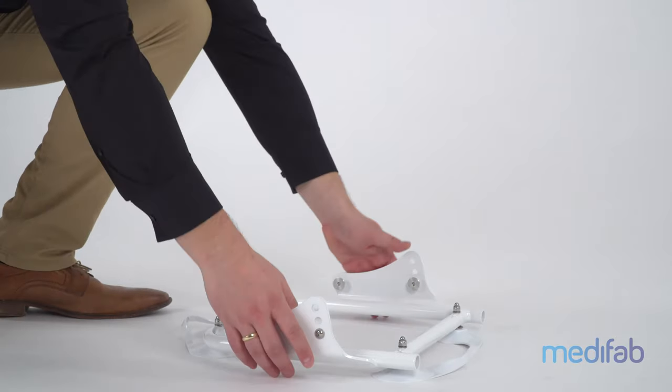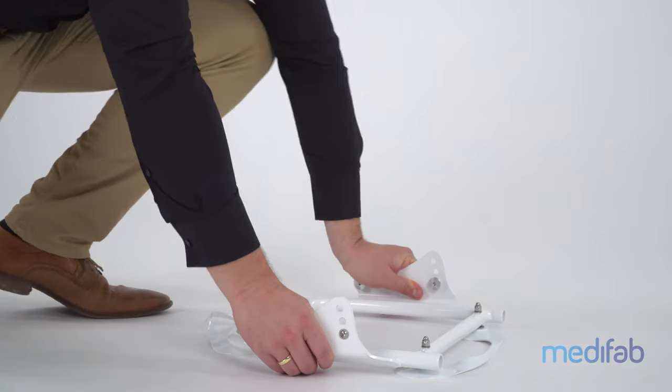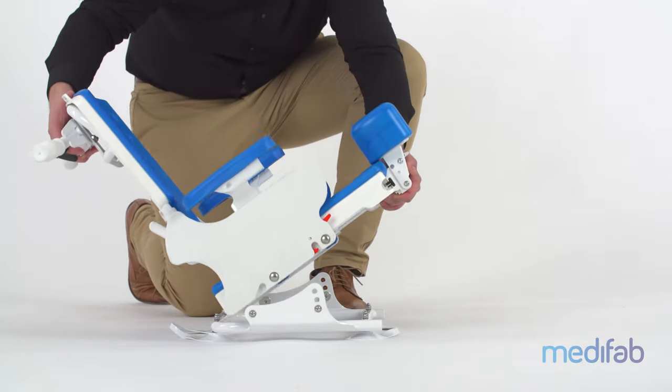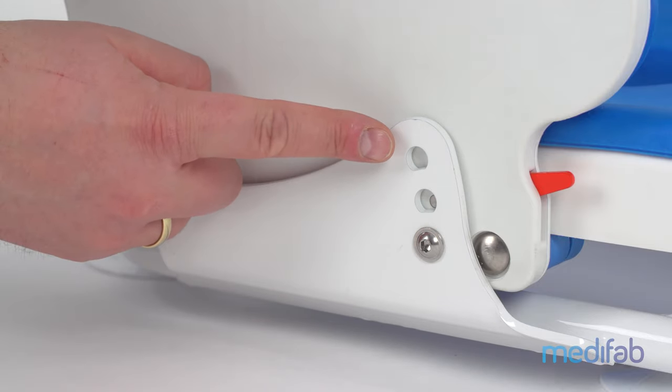For use in the bath, the subframe is first placed in the tub with the suction cups, then the seat can be installed. The extremely slim design means the Sharky can be used in almost all tubs. In addition, the seat angle can be preset to 0 degrees, 6 degrees, or 12 degrees.